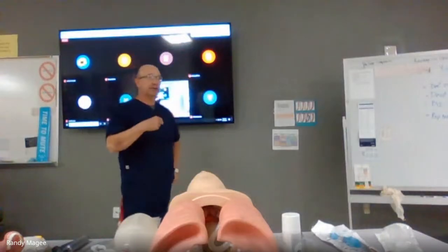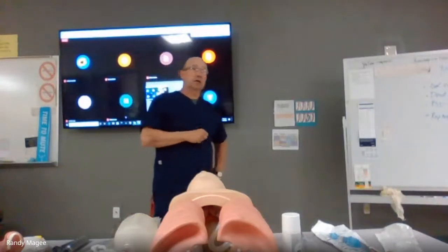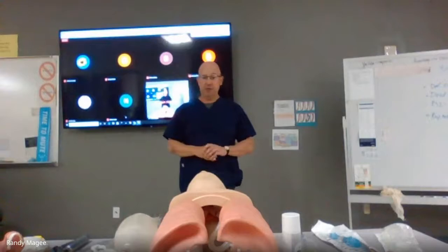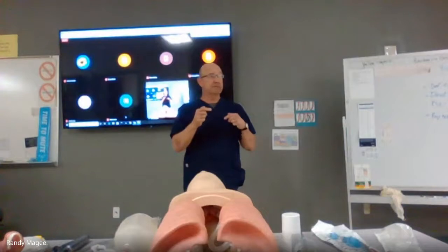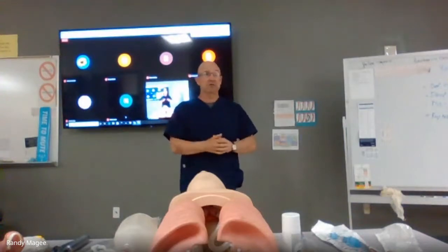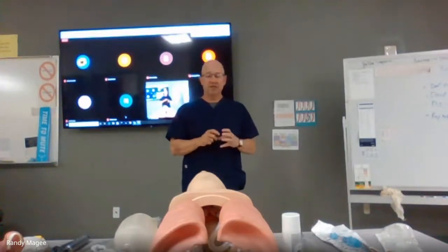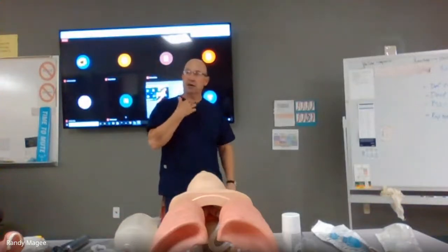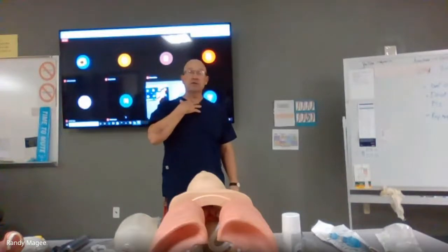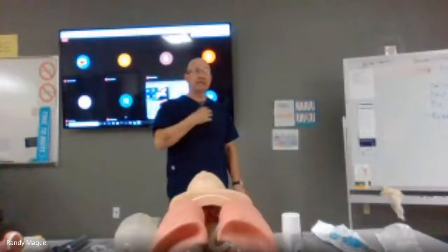Intubation, endotracheal intubation, okay, is what we consider definitive airway control. If I'm going to control my patient's airway for some reason, definitive means it's the absolute airway control. When you have someone intubated, you're in control of their airway. And it's definitive because of the endotracheal tube itself. It blocks everything off from going down. So fluids, vomitus, blood, secretions, whatever, it's going to block the absolute majority of it from going down the trachea.